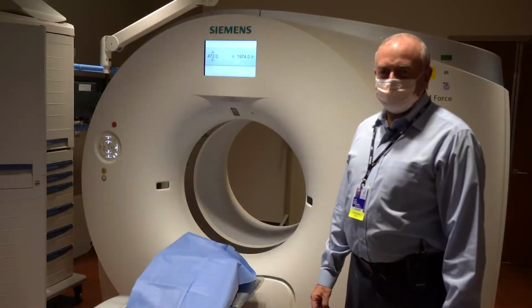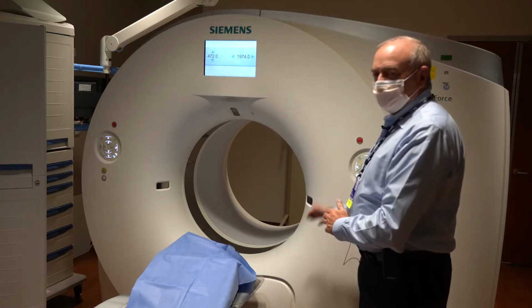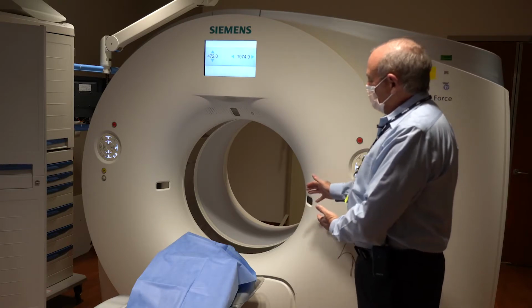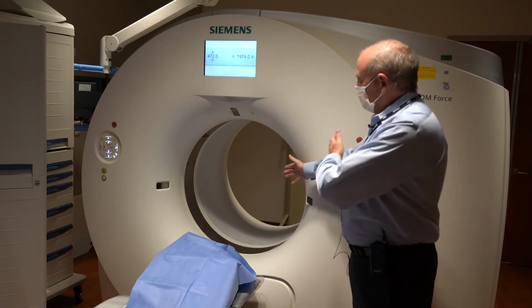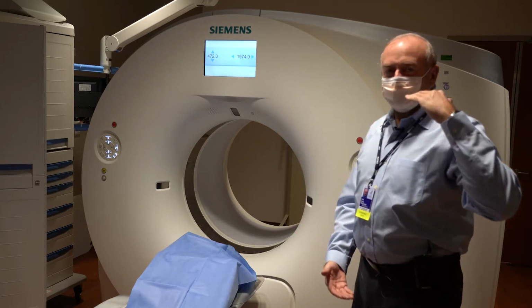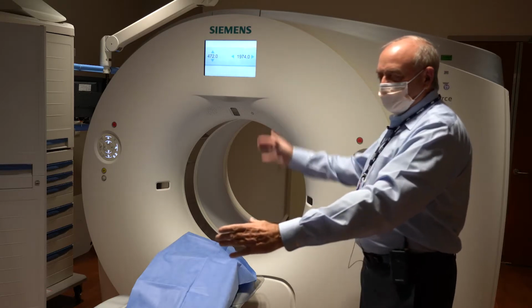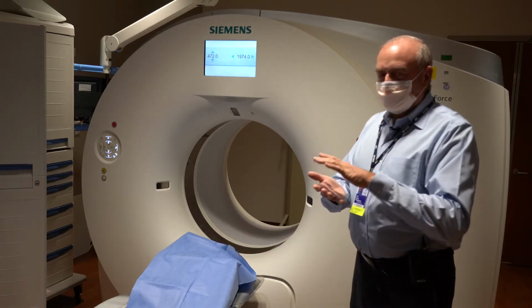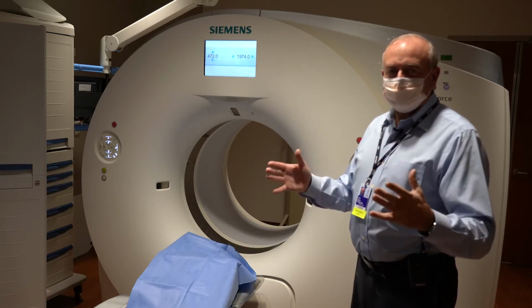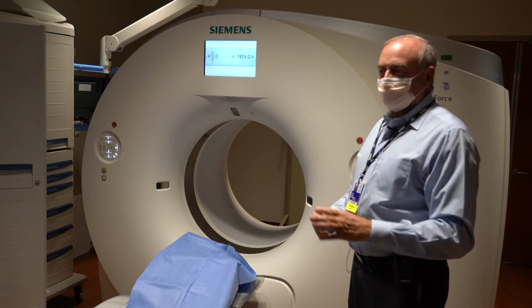So this is a CT, or computed tomography. And within here, there are two X-ray tubes in this particular case with detectors on the opposite side and spinning very quickly. So when the patient goes in, first we obtain a scout, and then from that information, we then range what part we want to image. And as the patient moves through the table and this is spinning, it ends up creating a spiral like a slinky. And then that data is processed into axial image data. Sometimes we push it as coronals. We don't need to here because we can process on the PACS.